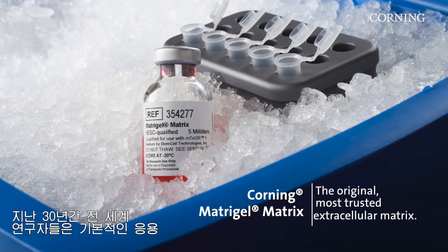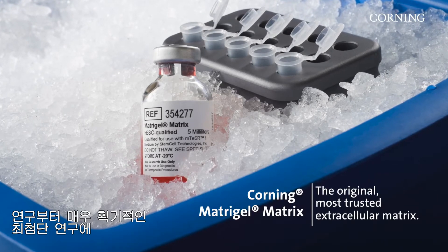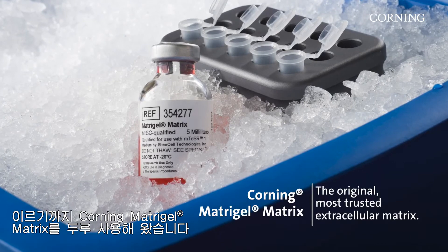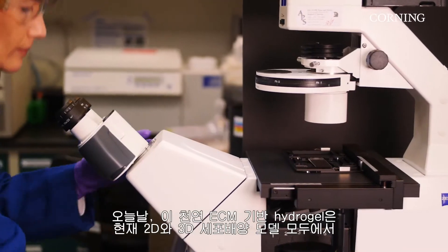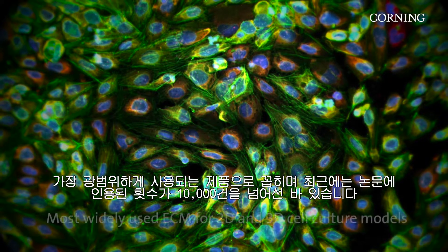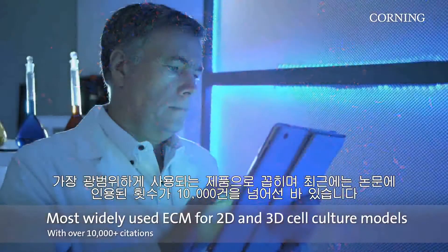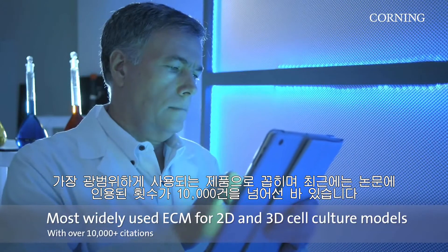For the past 30 years, Corning Matrigel Matrix has been used by researchers across the globe in essential applications through cutting-edge, life-changing research. Today, this natural ECM-based hydrogel is among the most widely used in both 2D and 3D cell culture models and recently climbed over the 10,000 citations mark.